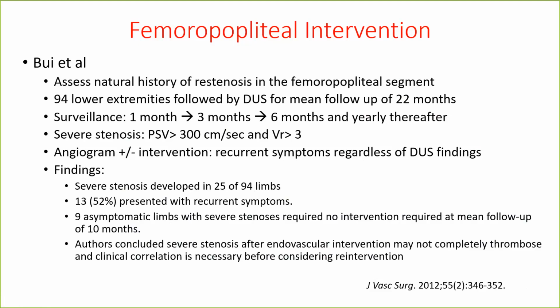Hence, these authors strongly recommended that after endovascular intervention, re-intervention should not be pursued based only on duplex ultrasound findings, but you should also look at clinical findings in these patients before you consider re-intervention.